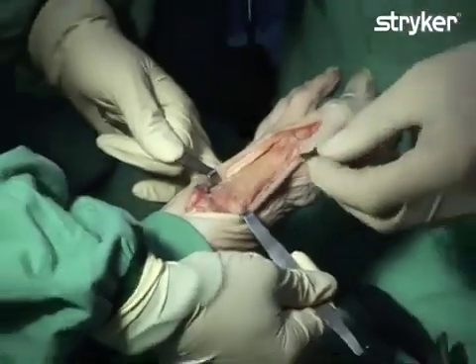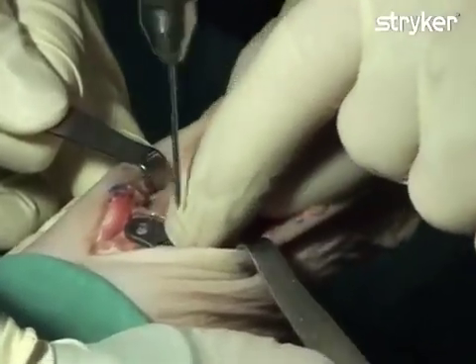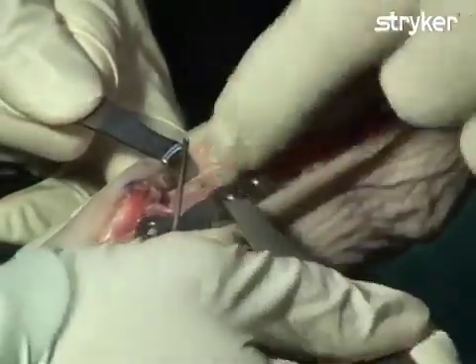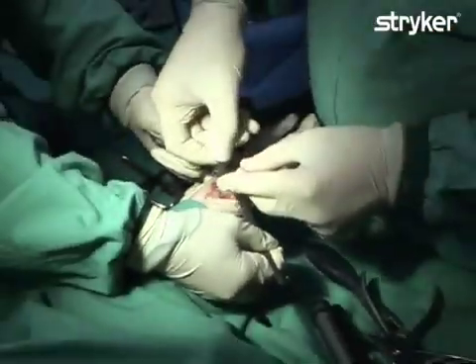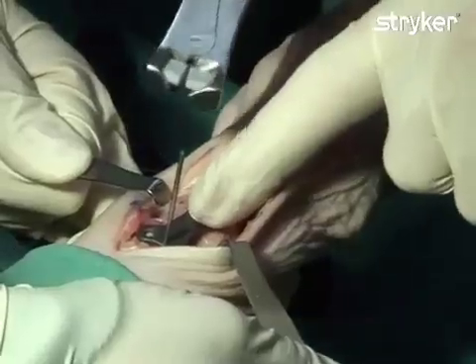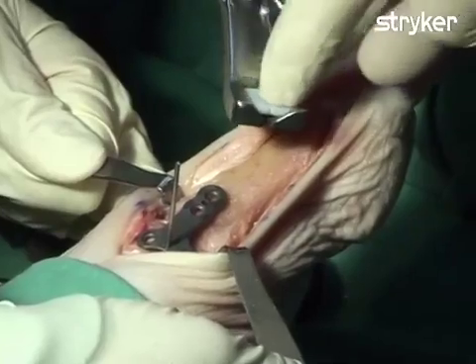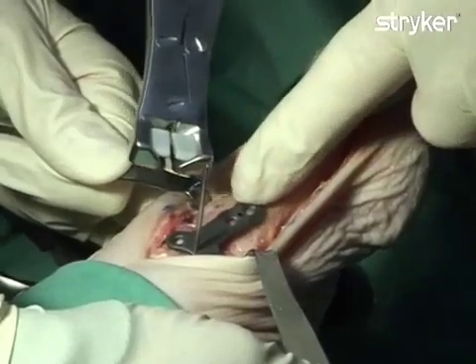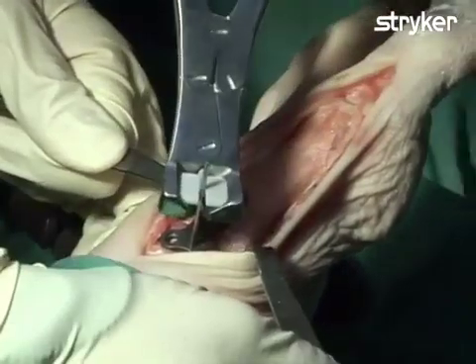The plate is provisionally held in place by inserting a K-wire through a K-wire hole within the plate and into bone. An advantage of provisional fixation with a K-wire is that the plate can be easily removed, manually bent using the bending pliers, and repositioned on bone. The excess K-wire is cut using the Variax Foot cutting pliers. These cutting pliers have silicone inserts designed to grasp and retain the cut edge of the K-wire, preventing it from being ejected and flying through the operative theatre. Care must be taken to place the K-wire in the region of the cutting pliers highlighted with an arrow, prior to cutting.